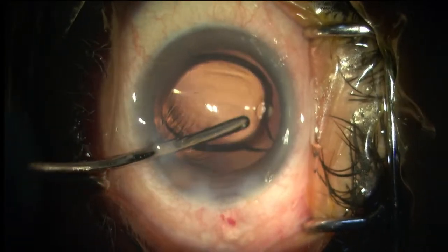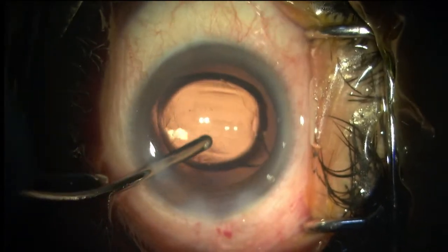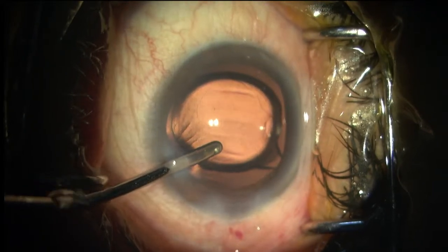So you put the long axis of the IOL on the long axis of the rhexis.